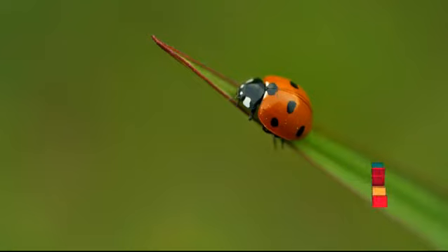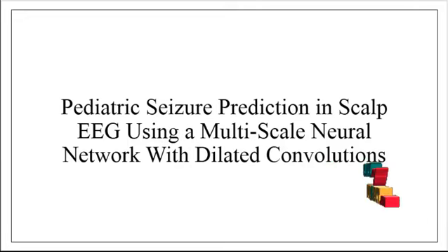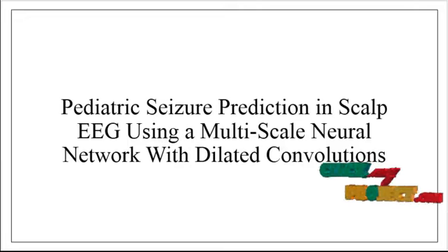Welcome to ClickMyProject.com. Now we are going to discuss the project Pediatric Seizure Predictions in Scalp EEG using a multi-scale neural network with dilated convolutions.